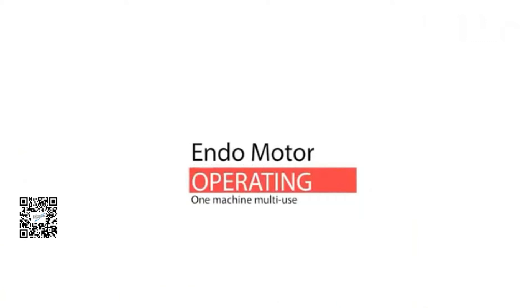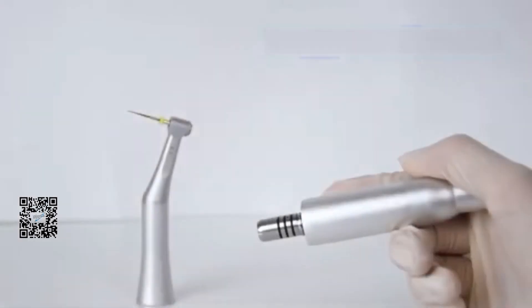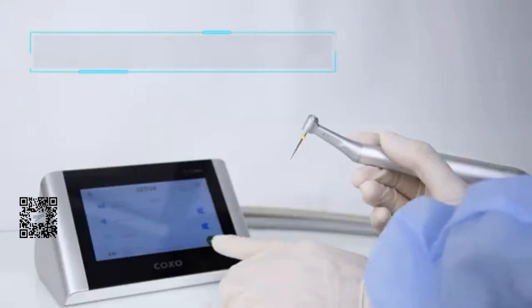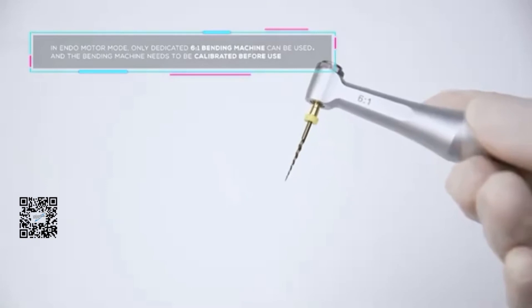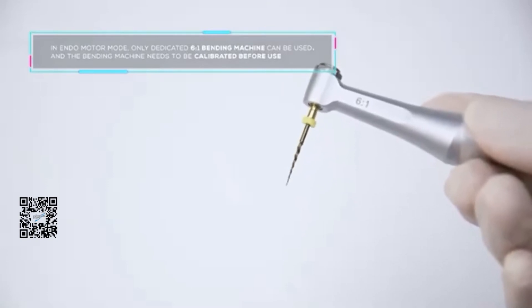Endomotor operation. Put the 621 contour angle on the motor. In endomotor mode, only the 621 contour angle can be used. The contour angle needs to be calibrated before using.